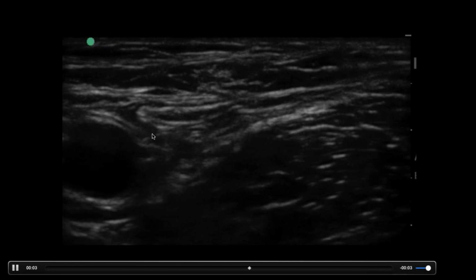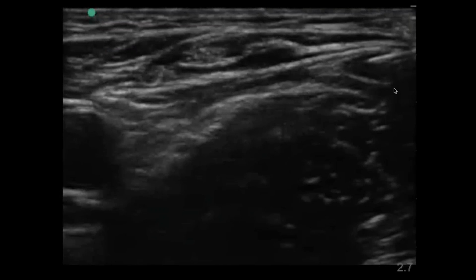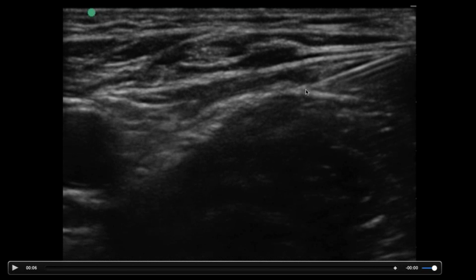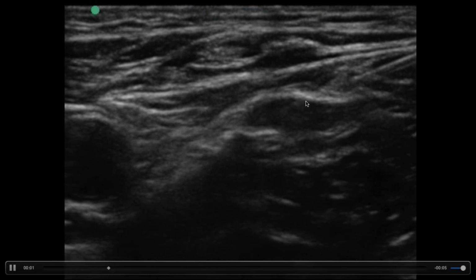So artery, nerve, fascia iliaca. Here you're going to see the bright white needle coming in, and you see that's the needle tip, and I paused it here to emphasize, so this is the fascia iliaca here, and that needle tip is going to just pop through that layer, and it can end right around here so that it doesn't enter into the body of the muscle belly, but also doesn't need to come right up against the majority of the nerve to infuse the anesthetic.